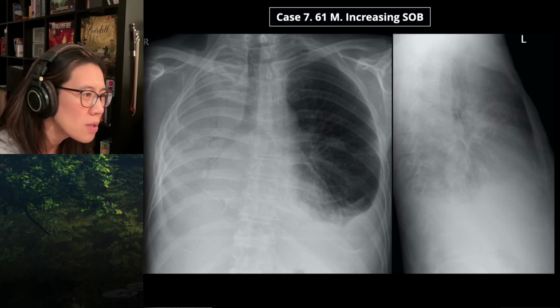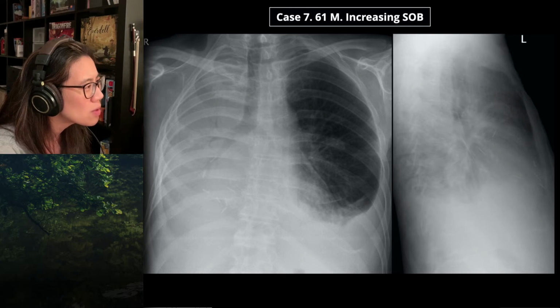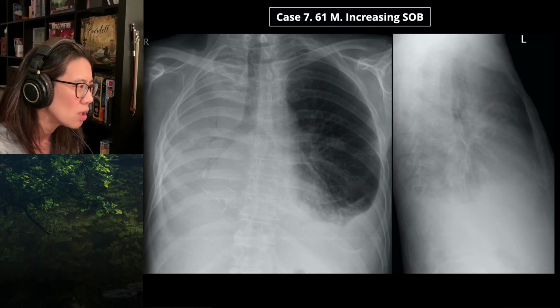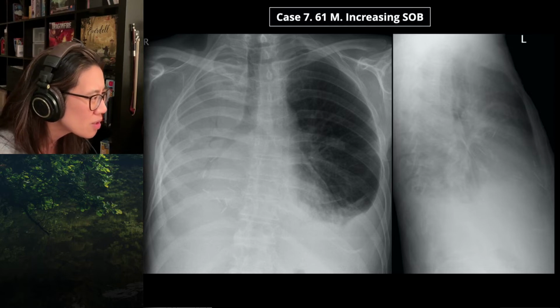lobe bronchus, and I think that's right middle lobe or right upper lobe? I think it's right upper lobe because it looks like it's coming off the right main bronchus. Yeah. So I can see, and then beyond that, I don't see that. That's unusual because really what we're proposing is a right lung collapse, but I would expect there to be a more centrally obstructing lesion to result in this degree of loss of lung volume. This is what's confusing me.